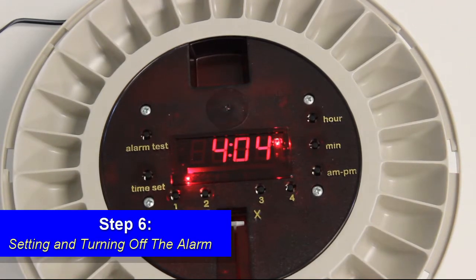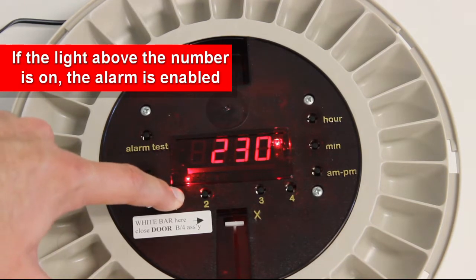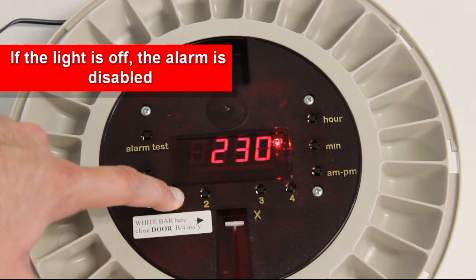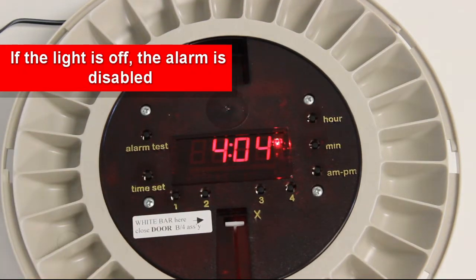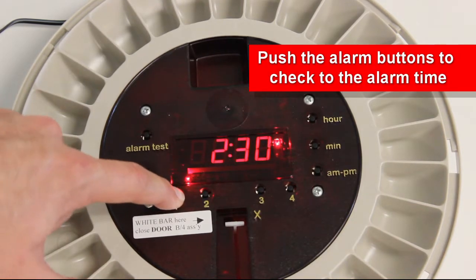Step 6: Setting and turning off the alarm. Hold down your designated alarm button. If the light above the number is on, then the alarm is enabled. If the light is off, then the alarm is disabled. Release the button once it is on your desired setting. To check the alarm time, press the alarm button.